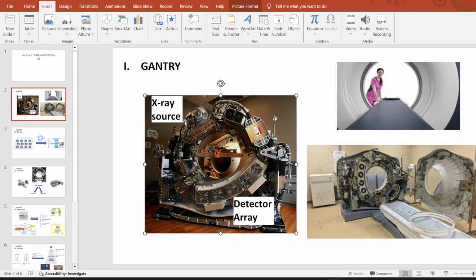You can see right here the X-ray tube, and right here the detector array, my friend. Look at that. It's a really big detector. And where is the generator? This is the generator. The memory just came back, the first time you see this. Magnificent. Speechless.